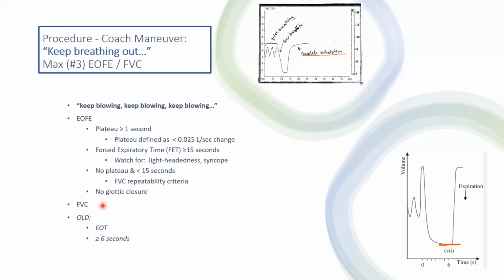Just a nod to some of us old timers. The end of test that was from the previous guidelines is no longer an appropriate measure, and the 6 seconds or more is no longer an appropriate measure.